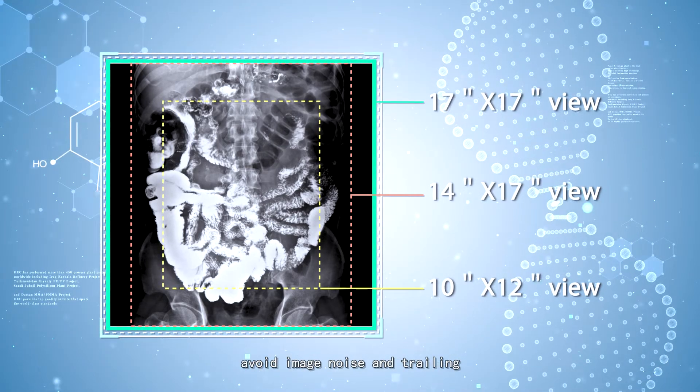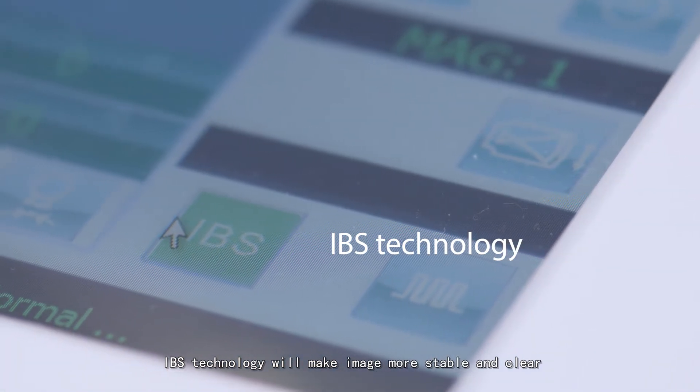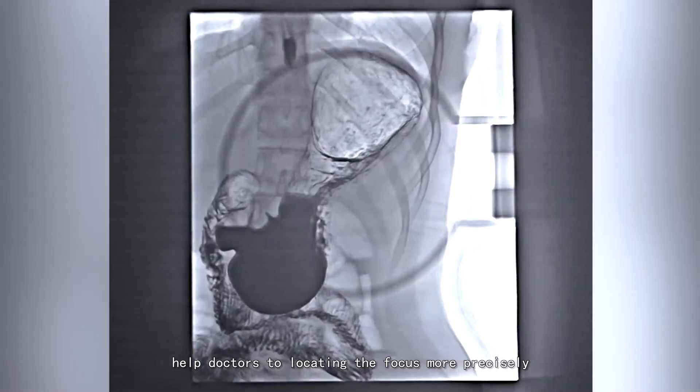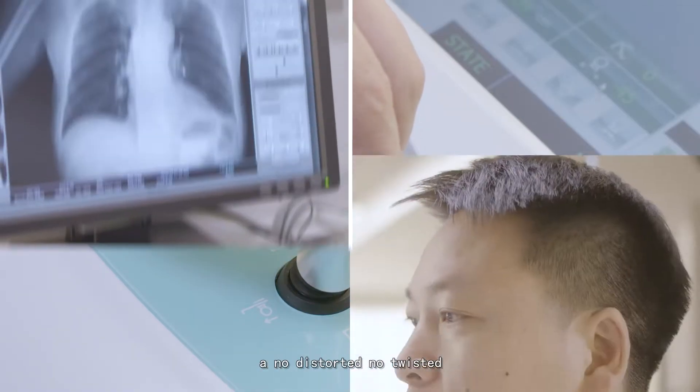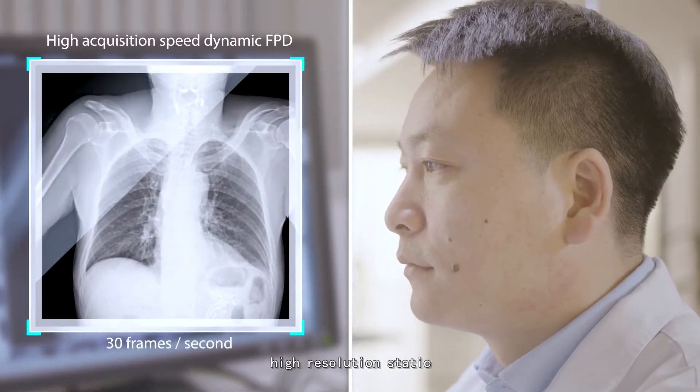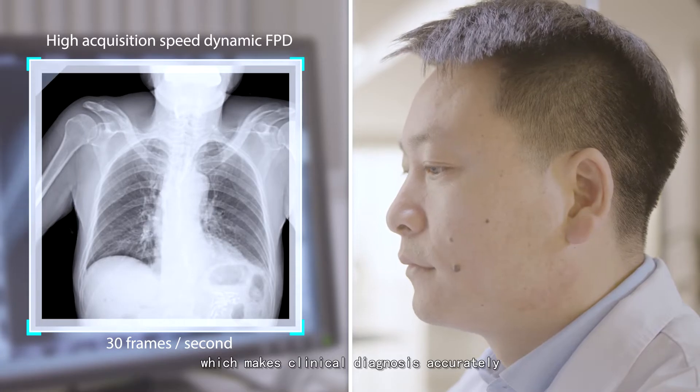IBS technology avoids image noise and trailing, making images more stable and clear, helping doctors locate the focus more precisely. The dynamic flat panel detector brings no-distortion, no-twisted, high-resolution static and dynamic images, which makes clinical diagnosis accurate.